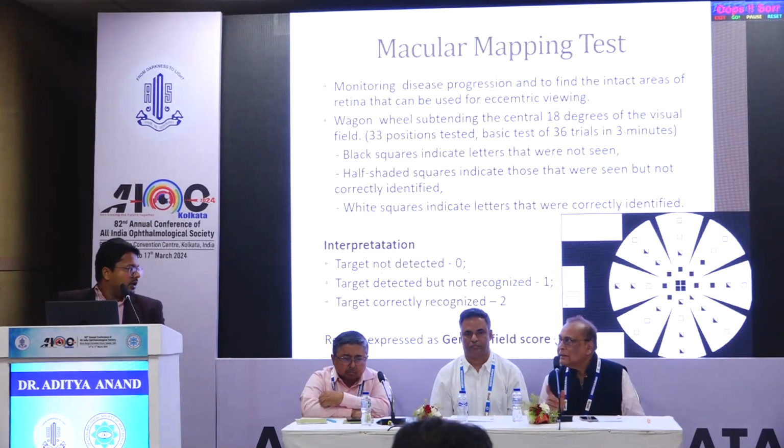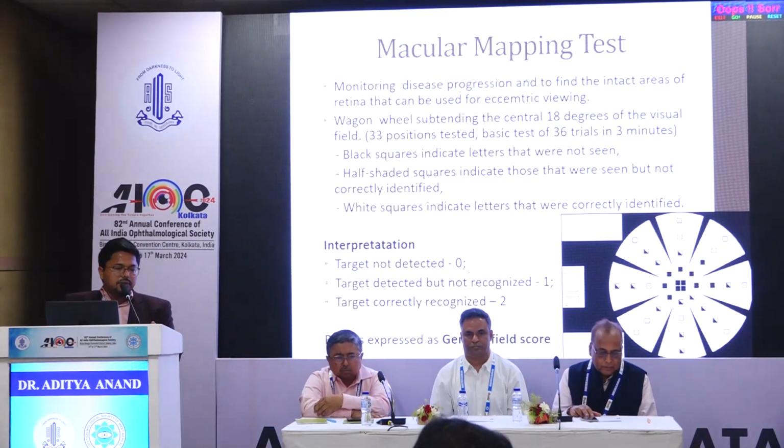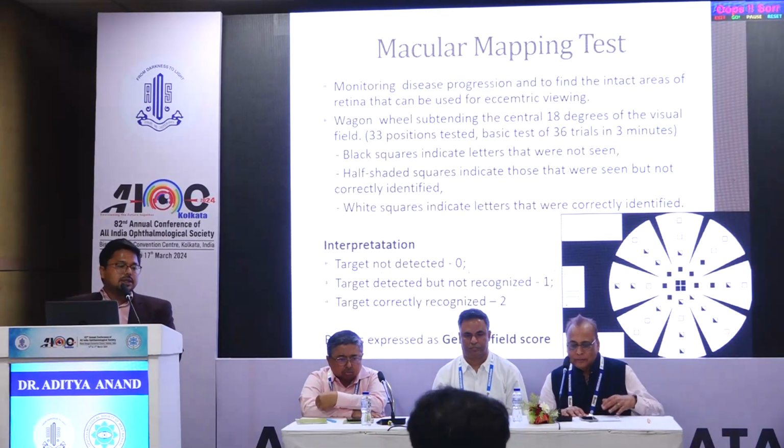Then the second test is the ERG, which is specific. Yes, ERG and VEP. And since the time is up, we can't discuss the others. There are a lot of tests, and a lot of new innovations are coming in this area.